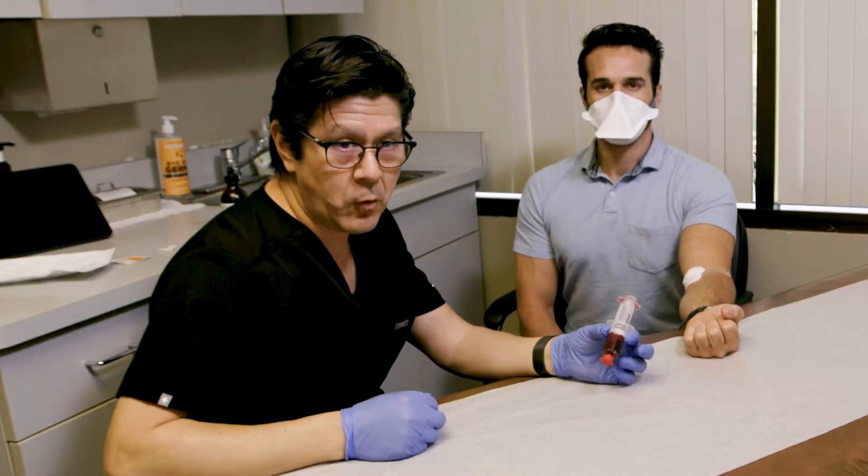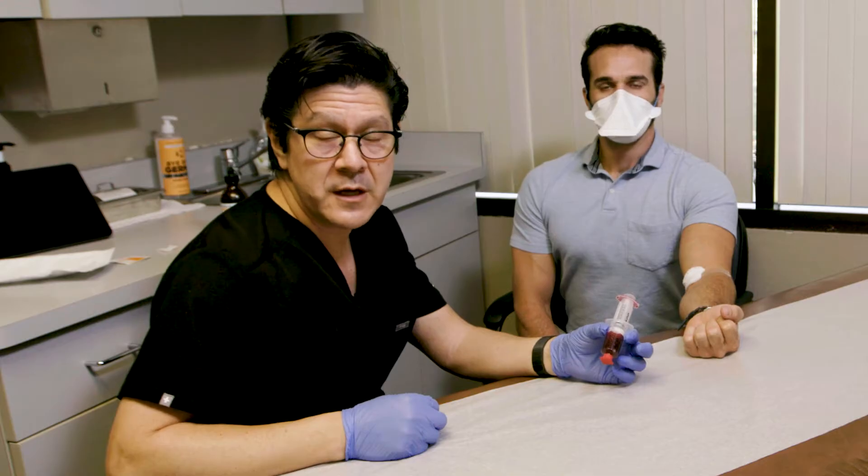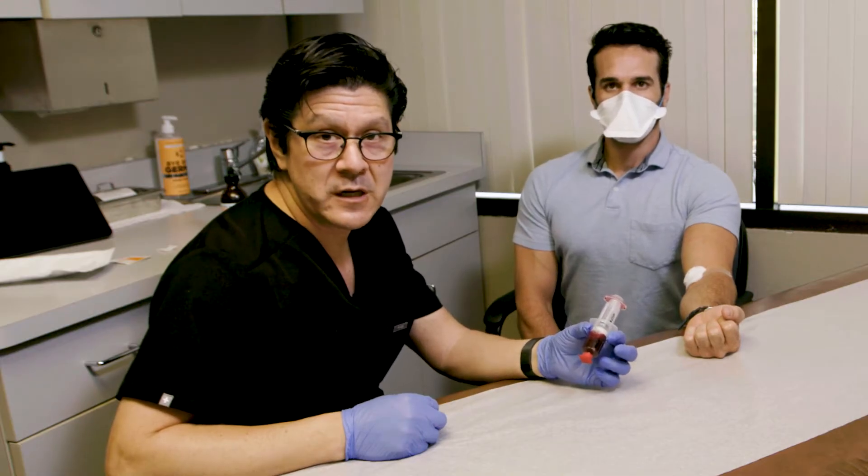Now we're going to spin this for 5 minutes in the centrifuge, and we'll have it ready for injection in 5 minutes.